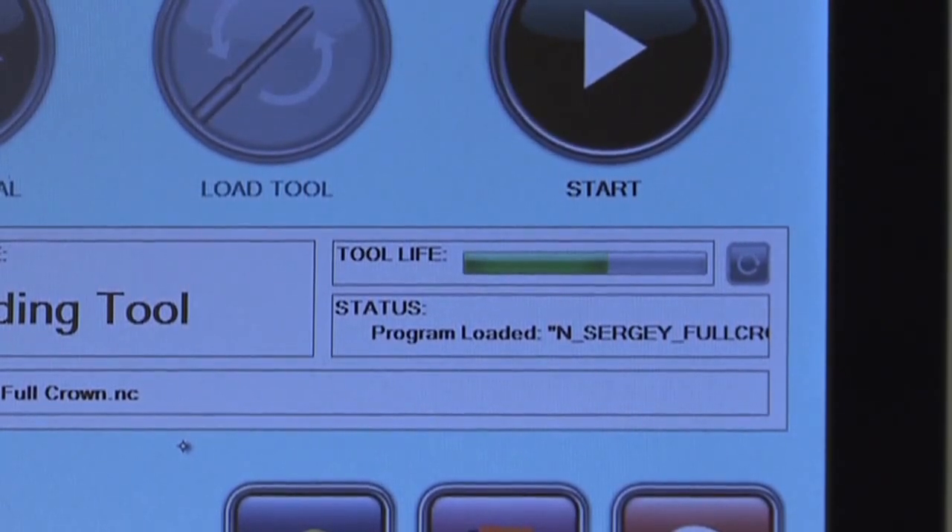The TS-150 keeps track of how many restorations have been milled with a particular tool and will prompt you to load a new tool if it has reached its useful life. The Tool Life Indicator provides a visual representation of how many more restorations can be milled before the tool will need to be changed.